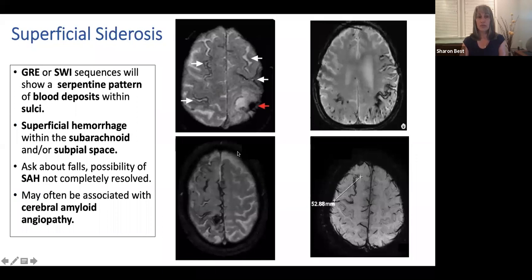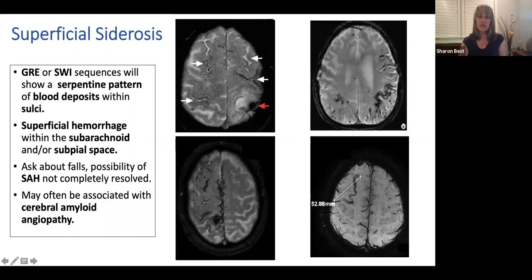We also have something called superficial siderosis. The subarachnoid space has many little vessels; if those vessels have cerebral amyloid angiopathy, they can also hemorrhage and the blood will travel around the sulci in a serpentine fashion — just like a subarachnoid hemorrhage would. We're going to look at the GRE or SWI sequence to pick up any blood products, whether superficial siderosis or microhemorrhages.